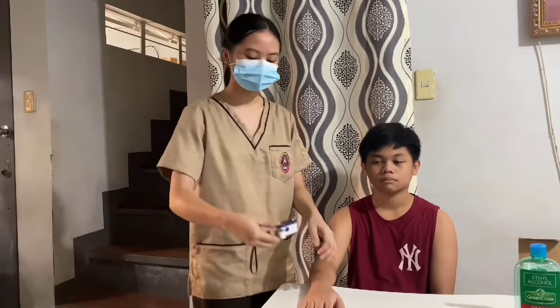And now we will place the pulse oximeter on the client's finger. Sir, may I? So the middle and the index finger are the best location for the pulse oximeter to be placed. And we have to ensure that the light or the waveform on the face of the oximeter is fluctuating with each pulsation. And we will connect the sensor probe to the pulse oximeter and turn on the pulse oximeter, and we have to check for the operation of the equipment.